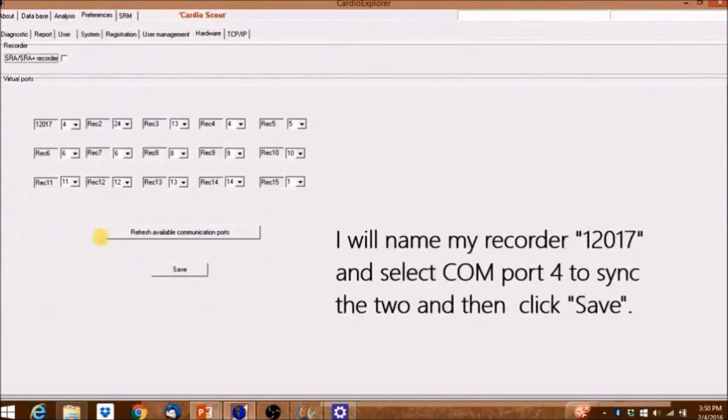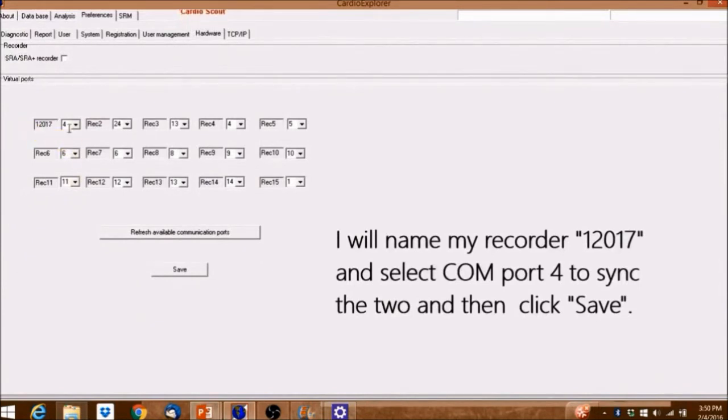I'll name my recorder 12017 and select COM port 4 to sync the two and then click Save.